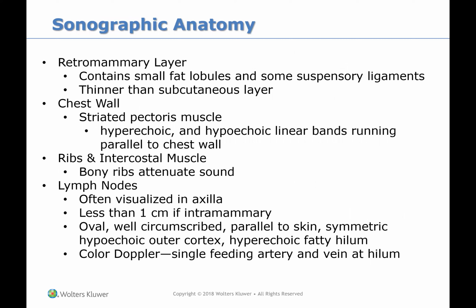And there's the retromammary layer, which contains small fat lobules and some suspensory ligaments, and it's thinner than the subcutaneous level. You'll see the chest wall and ribs, lymph nodes. You can see in the axilla, they should be less than 1 centimeter if they're in the mammary area.